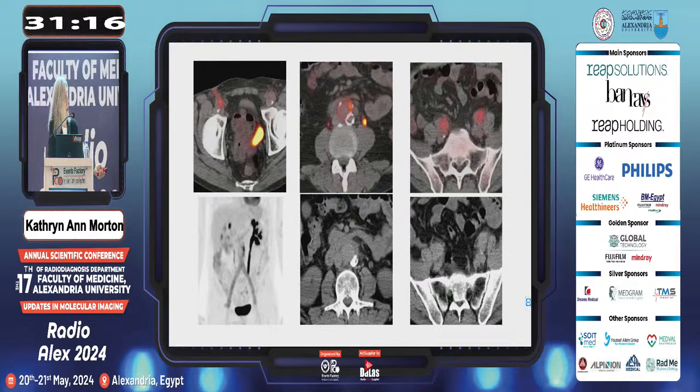This is a patient who had a bypass graft for atherosclerotic disease, and periodically the groin wound would break open and would ooze pus. That's not a good sign generally. They wanted to know what the extent of infection was. They suspected infection, and if you'll notice here, there's just intense uptake, both of the common iliacs here as well as the aorta. And the CT corresponds to a small amount of fluid around this lesion. So this is an infected aortobifemoral graft.